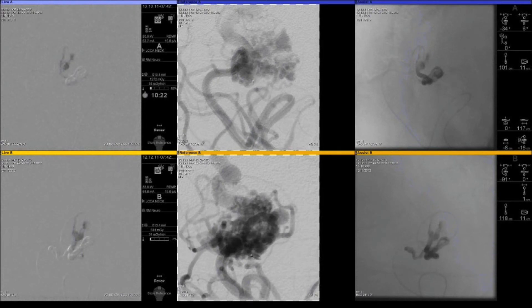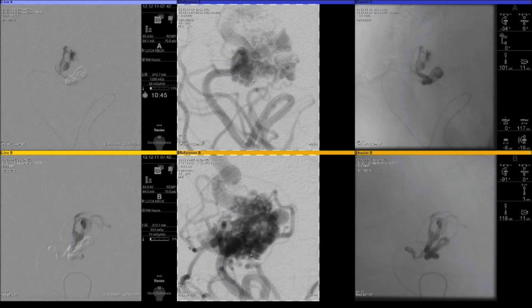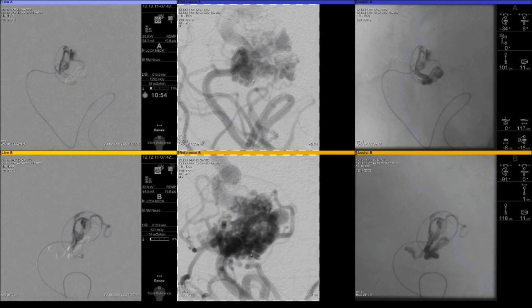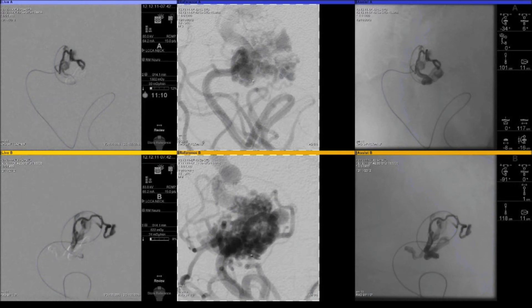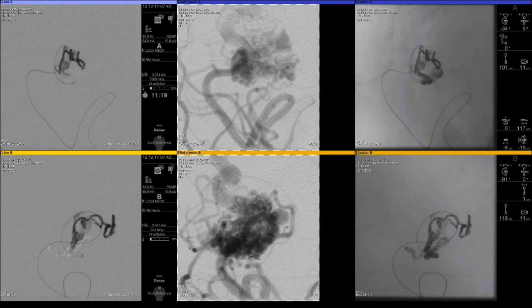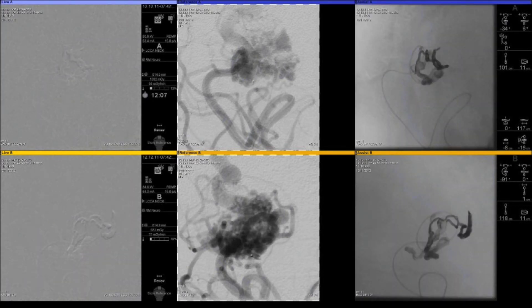The ideal pedicle we picked is an important aspect of decision-making — a pedicle that is as straight as possible, with the least amount of branching vessels, so that you allow yourself to have controlled reflux. The larger pedicles will, in general, allow you to have a safer catheterization. Those are very important initial thoughts when choosing the area you are going to be catheterizing or approaching the AVM.